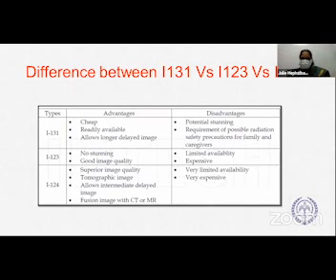And what are the different isotopes that we know of iodine and what are its uses and where it can be used? Iodine 131 is the most easily available, and throughout our country we are using iodine 131 because of its ready availability and it is cheaper. And it also allows longer delayed image because the half-life is about 8 days. But the disadvantage is that we need to have some safety precautions for family and caregivers because it has both the beta emitting radiations. Whereas iodine 123 is the most ideal isotope for gamma imaging.